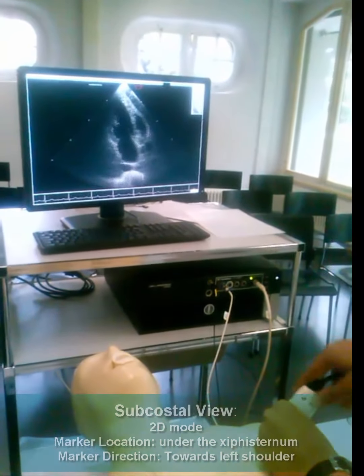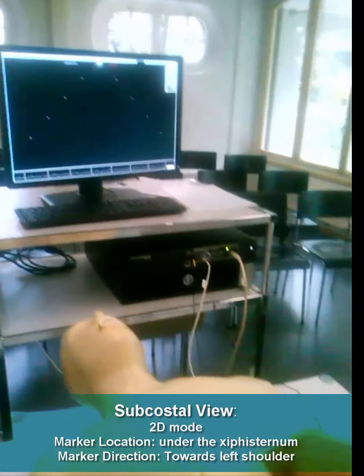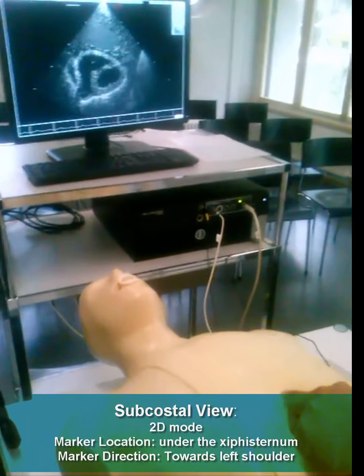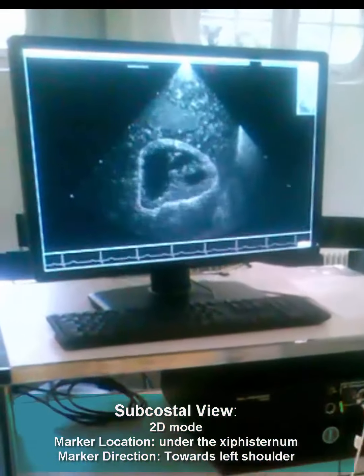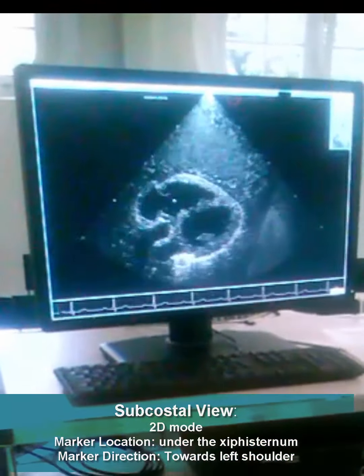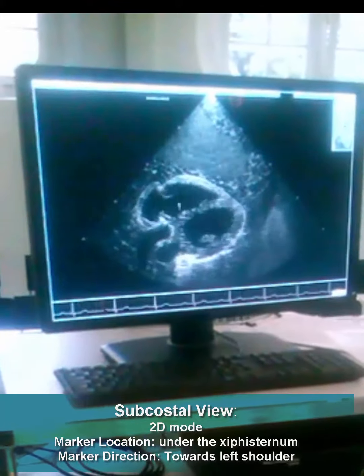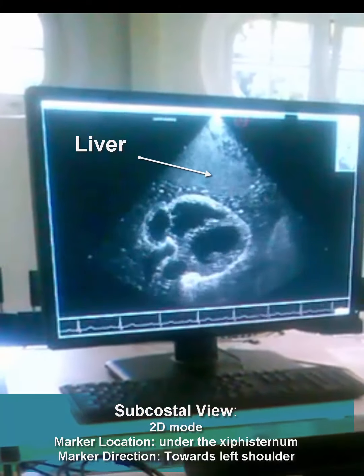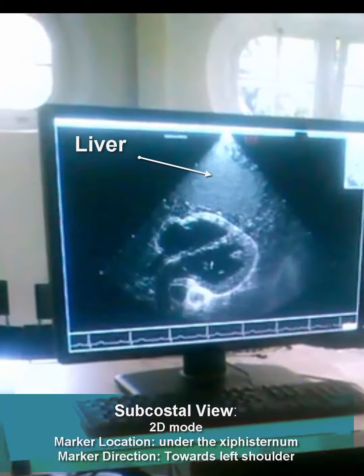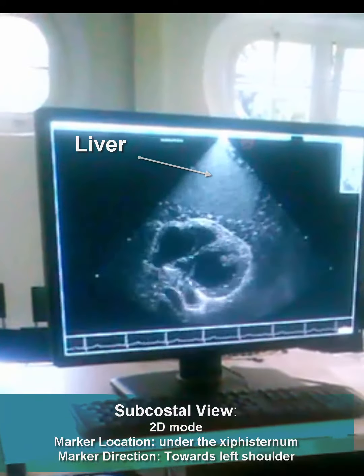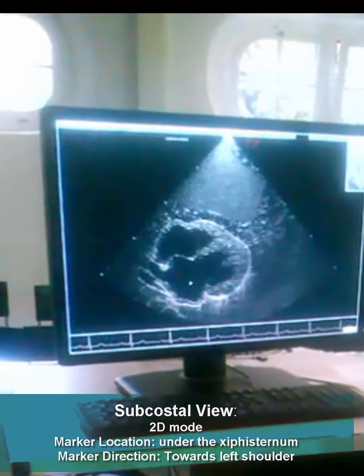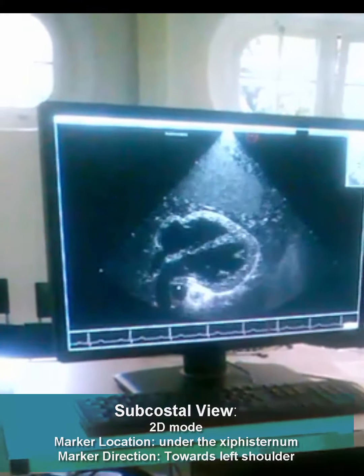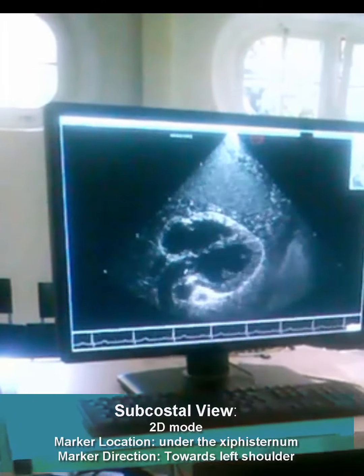We will move to the subcostal view. As you see now, this is the liver. And this is the right side of the heart and left side of the heart — right ventricle, right atrium, tricuspid valve, left ventricle, left atrium, mitral valve. You can see the aortic valve here.